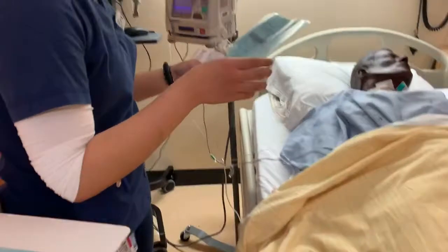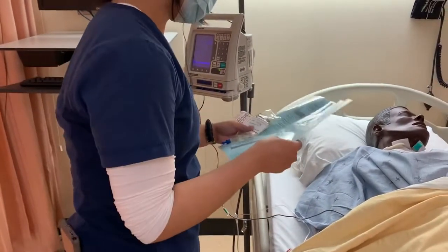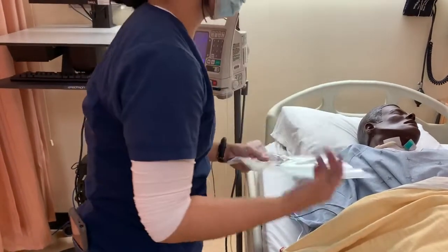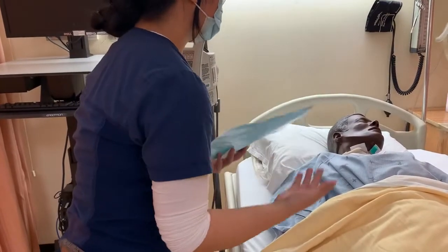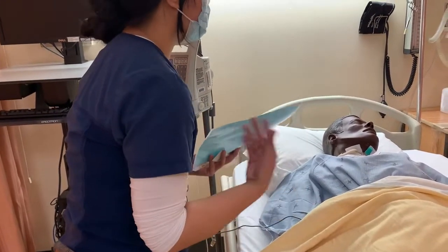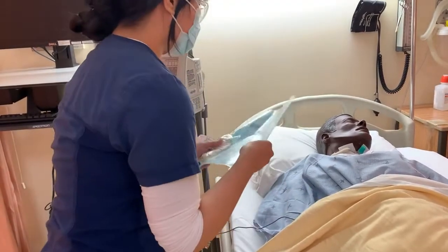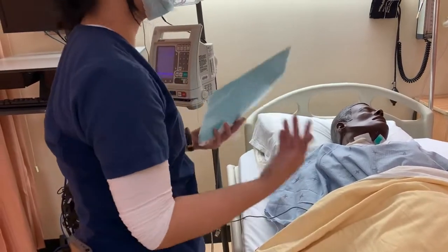So, just like I said, this medication is morphine. This is gonna help with your pain. And this one, so you usually have it in this bag. We already monitored your vital signs for this. It's stable, it's appropriate. And we're giving this medication because you just had surgery, you're in so much pain, and we want you to be in control of your pain management. So do you have any questions about that? Is it okay to get this medication? Patient consented, so we're good.